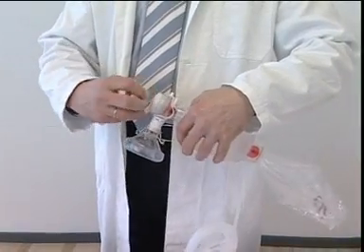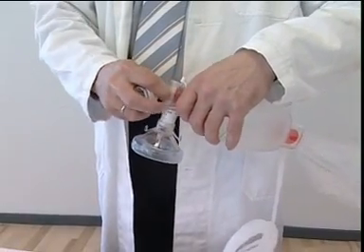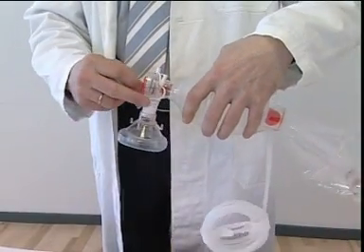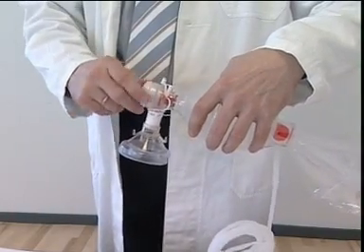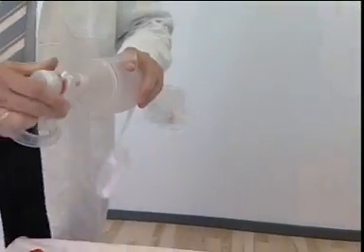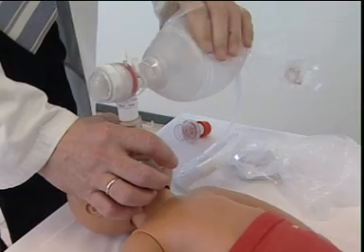If it is necessary to clean the patient valve due to foreign bodies, take off the splash guard, unscrew the expiratory connector, and take out the red valve. Clean the patient valve, the splash guard, the expiratory connector, and the red valve. After cleaning, put the red valve back into the patient valve. Then screw the expiratory connector back on and attach the splash guard. Ventilation can now be resumed.